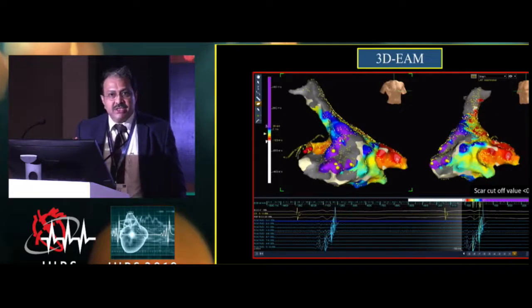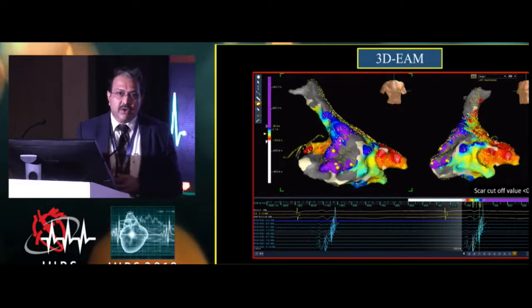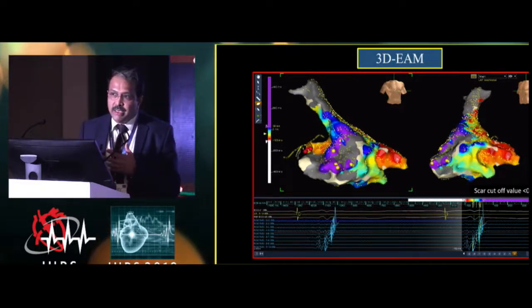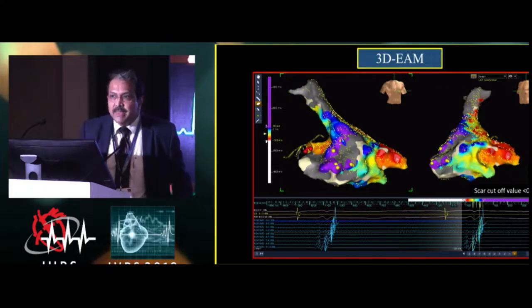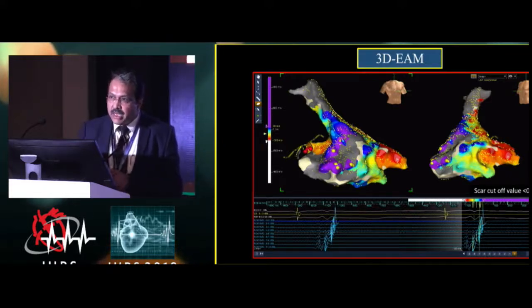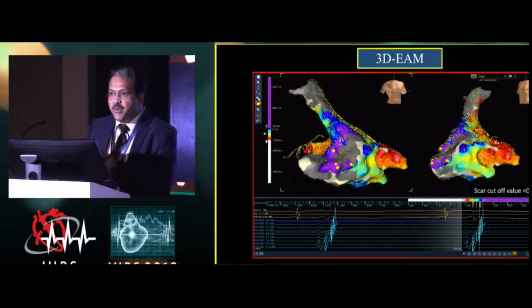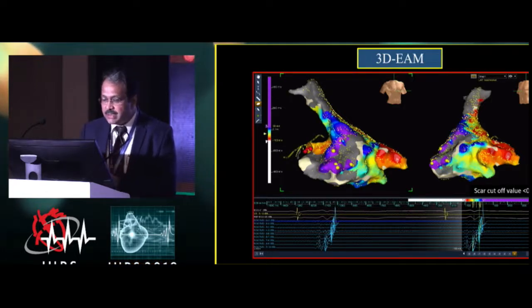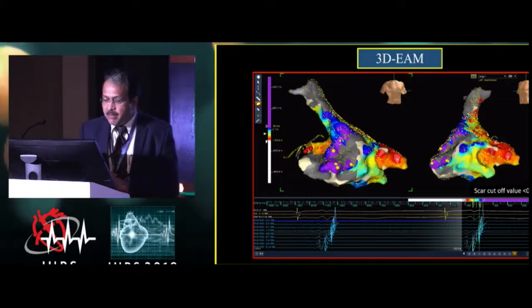So now, when this patient was taken for the ablation, there is this feasibility of overlapping the imaging anatomy, the scar anatomy. On top of that, now that we have these advanced catheters, you can overlap the late potentials or the fragmented potentials map on top of the conventional 3D electroanatomic mapping. So for example, typically you can notice the trigone area of the tricuspid wall, a little bit extending into the RVOT, with the purple colored map.